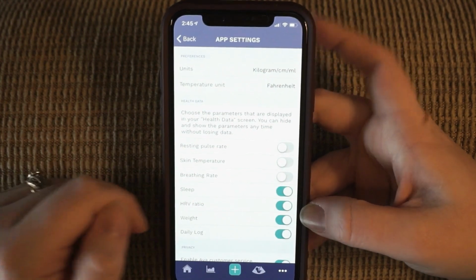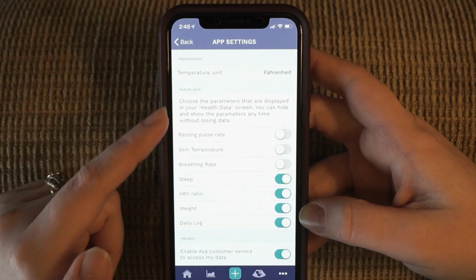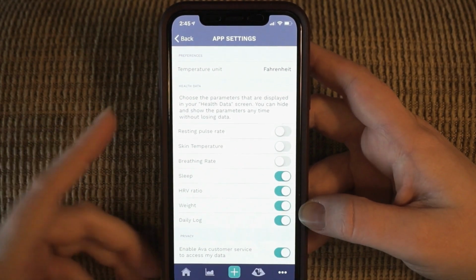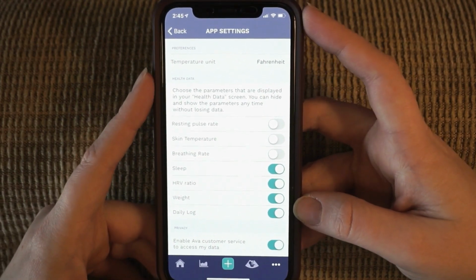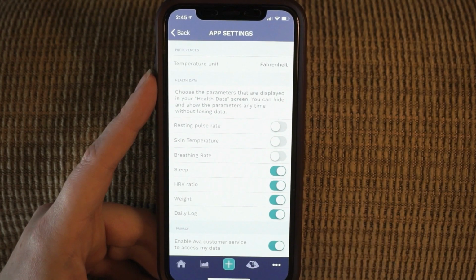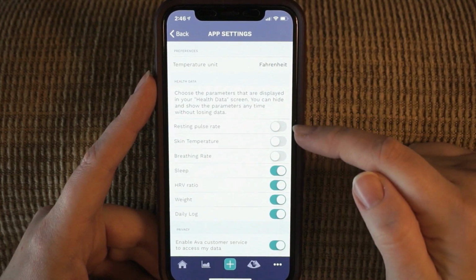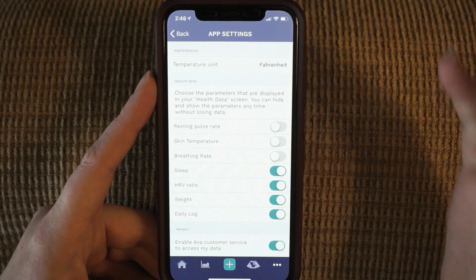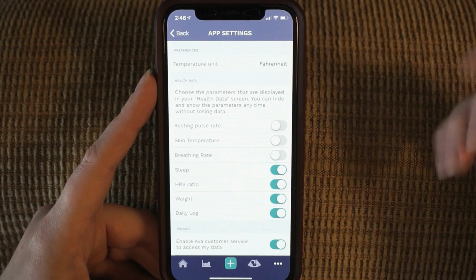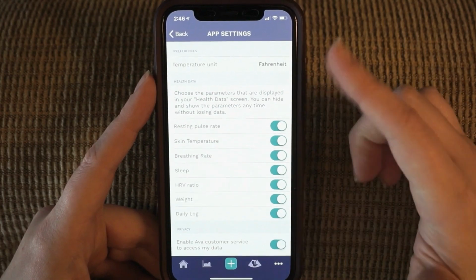I also wanted to show you that one of the most useful things I found with the update was the fact that you can go into app settings and you can now choose what it shows you and what it doesn't. In the first few weeks of knowing that I was pregnant, like I said, I have suffered from recurrent pregnancy loss in the past, so I was very, very nervous about seeing a drop in things that I knew should probably still be increasing. So for that reason, I was able to turn them off. I've just kept them off for that reason. It's still tracking them. If I turn it back on, you'll see that we'll be able to see that information. You could turn any of this off.